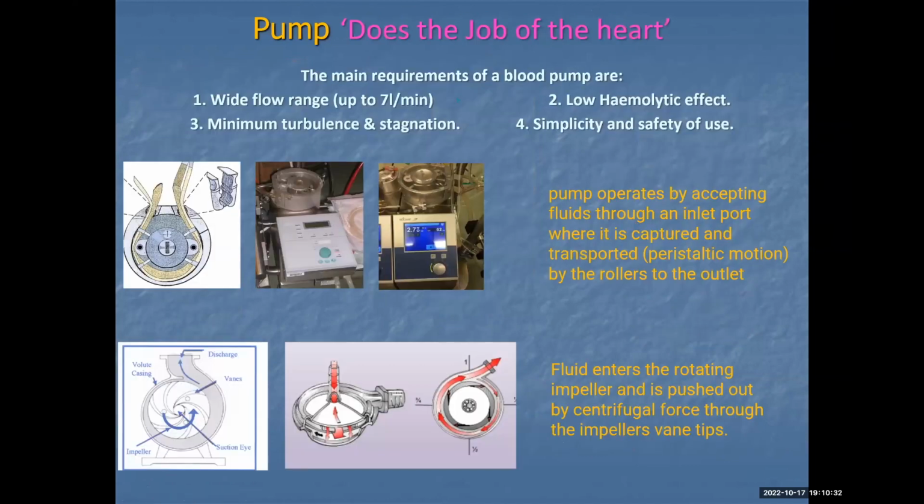So a little bit more in depth. Again, I'm going to show you what we do, but I don't want to tell you just what we do at Glenfield or at UHL. If you go to another hospital, it will look completely different, and that's because certain centres prefer to use a different type of pump through experience.